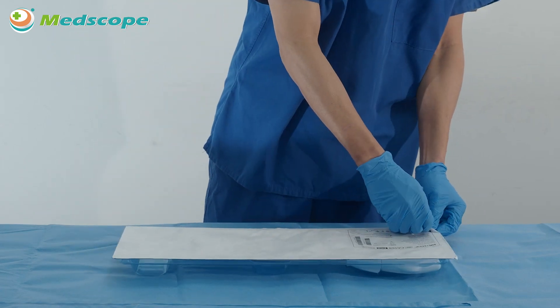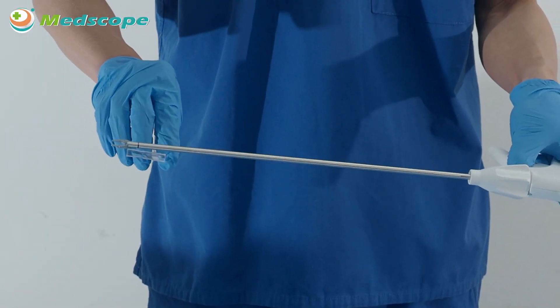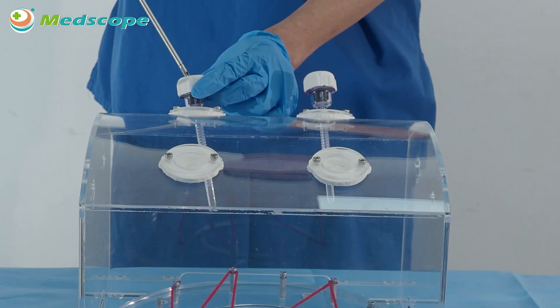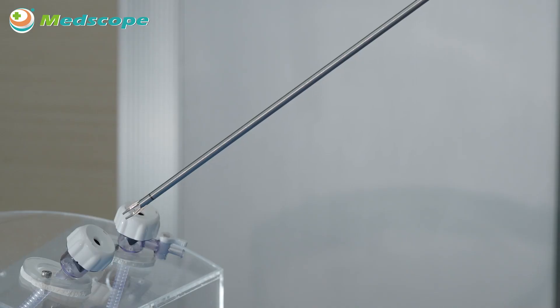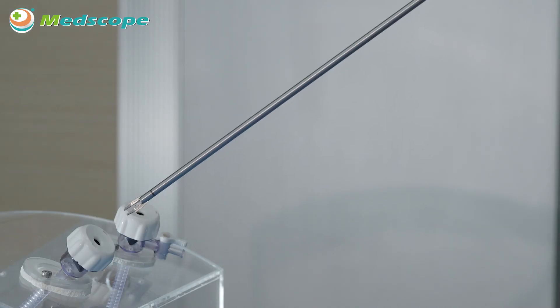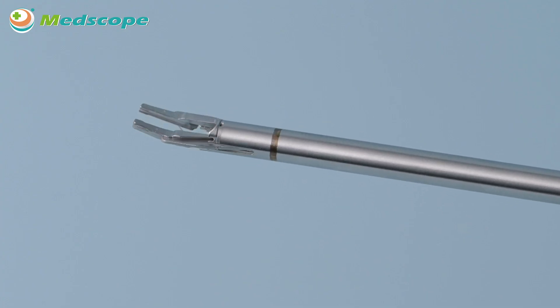C-A56 series 5mm single-use clip applier instructions: 1. Peel off the stabilized blister packaging. 2. Take out the clip applier and pull up the release plug from the shaft. 3. Insert the clip applier into a proper size trocar. If you need to insert the clip applier again during an operation, please ensure the clip is not preloaded into the jaw to prevent the clip from dropping off into the body of the patient.